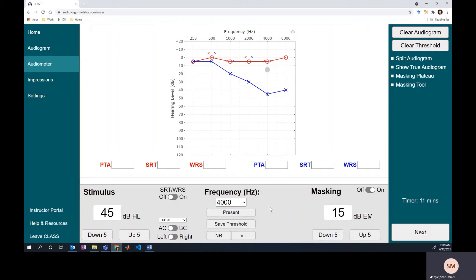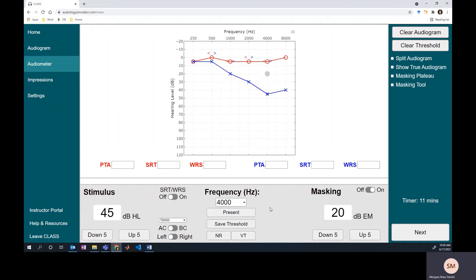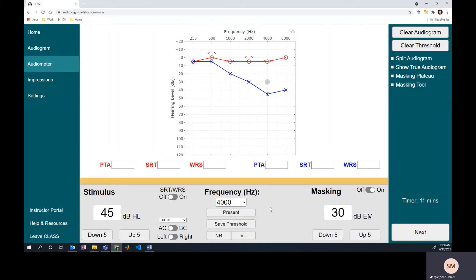We present the stimulus and we get a response. Well, maybe our safety pad just wasn't quite big enough. Could this still be the right ear responding? We can make sure by just continuing to raise the level of the masker. We'll go up 5 dB and then we'll present again and we still get a response. So maybe this is the true threshold. Let's check two more times just to be sure. And now that we've confirmed that even with a very high masker level we're still getting response, we can feel more confident that there is no way the right ear is responsible for that response. This must truly be the left ear threshold.